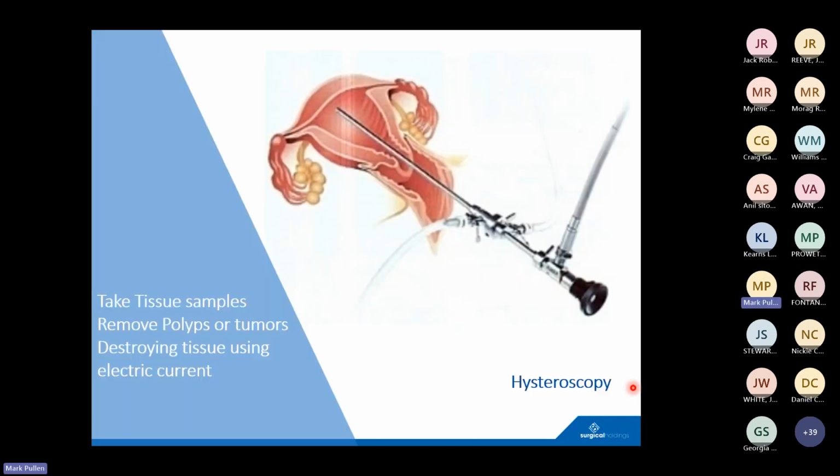And hysteroscopy. Hysteroscopy is the exam of the inside of the cervix or uterus using a thin, lighted, semi-flexible tube called a hysteroscope. This can aid the surgeon when taking tissue samples, removing polyps or tumours, or destroying tissue using electric current.